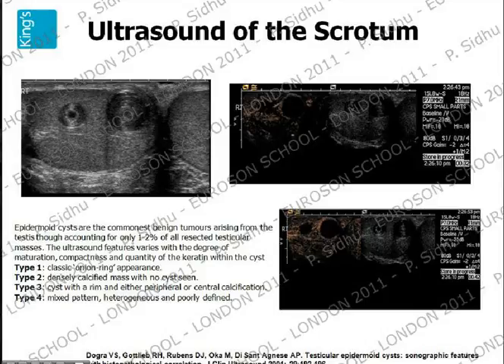vascularity at all. And this is an epidermoid cyst, almost classical on the B-mode appearances, but you want to be sure. You can't send this 17-year-old patient home without being absolutely sure that's what you're looking at, particularly if his father is a consultant radiologist and he's in the room, and his uncle is a consultant urologist and he's in the room. You got no chance. So you've got to make sure you know what you're doing, and there's absolutely no vascularity in that area. You know it's going to be a benign abnormality, and you can watch and wait and elect not to immediately take the patient to surgery.